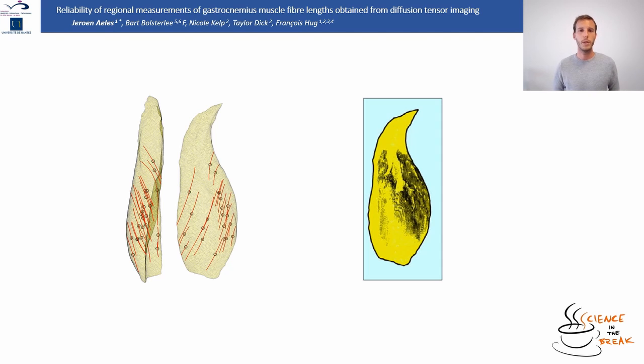So what we did is we took the midpoints of the fibers, which you can see here on this slide. So again, I've taken maybe 10 fibers or so in red, and then in black, I've highlighted the midpoint. So the midpoint is exactly what it says. It's just the middle of the fiber. And then we do this with all of the fibers that we have. Like I said, we have a lot, and that's what's shown on the right. So all these black little dots are the midpoints of all of the fibers that we've reconstructed in this participant, in this calf muscle.